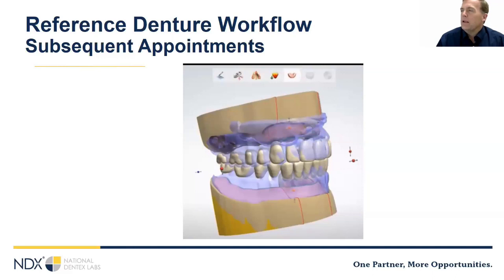So your first appointment is scanning the reference denture. Your second appointment will be the printed or milled try-in, and the third one will be delivery. So this gets you a good, solid procedure to get to a final denture in 3 appointments.